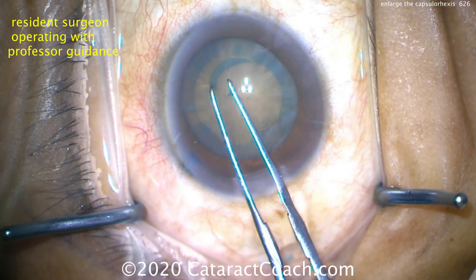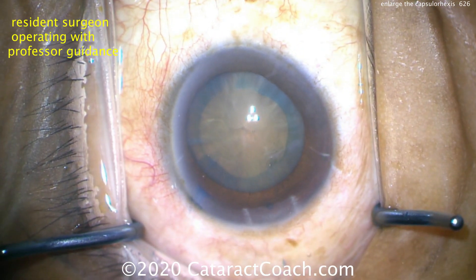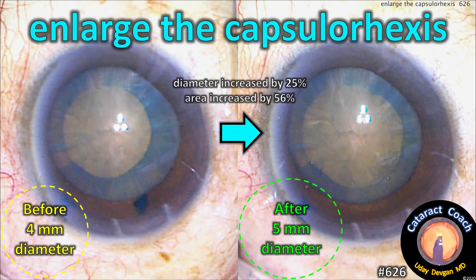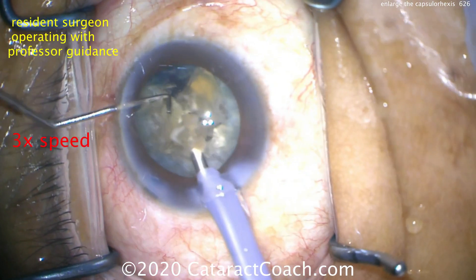But now look — the capsular opening, the capsorhexis, is now 5mm diameter. So while the diameter only increased by 25% (4 to 5mm), the area of the capsorhexis increased by 56%. Remember, pi r squared.